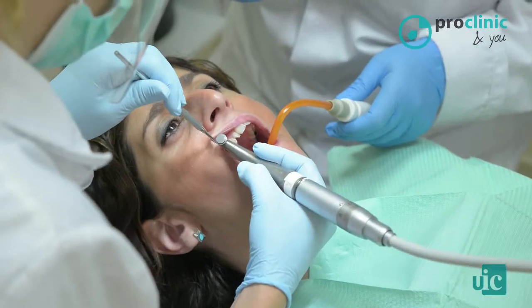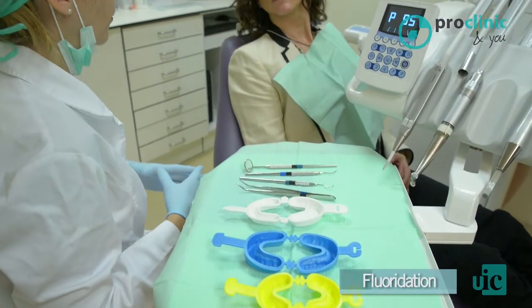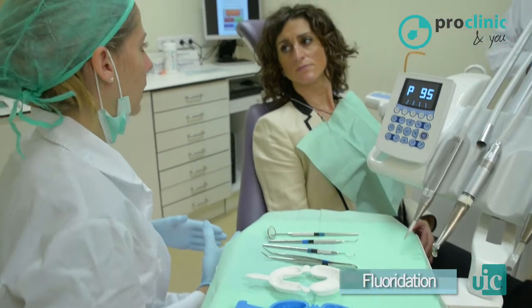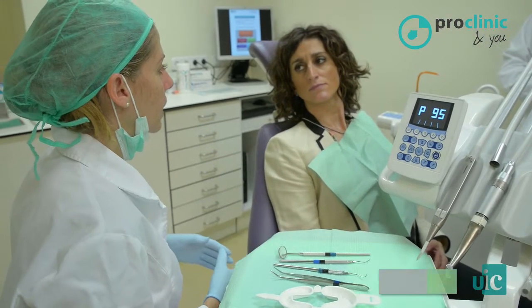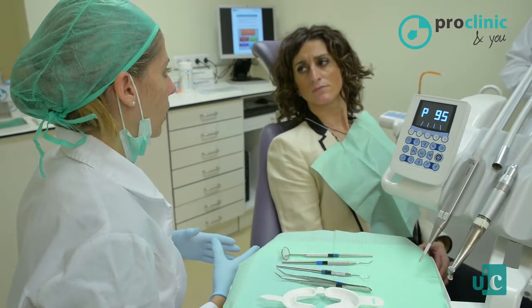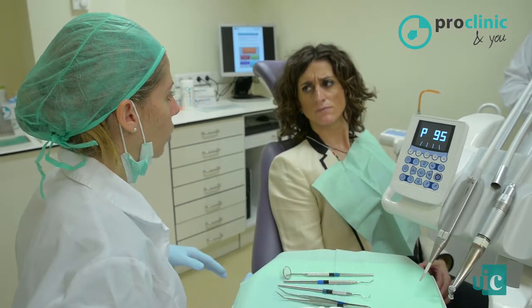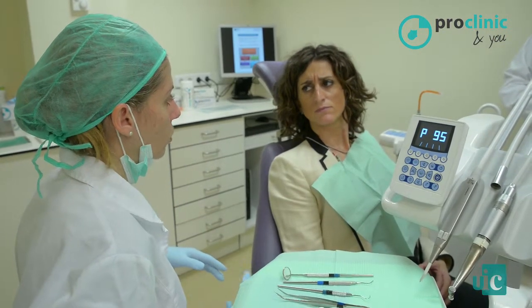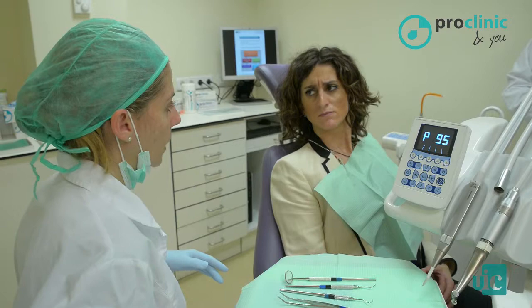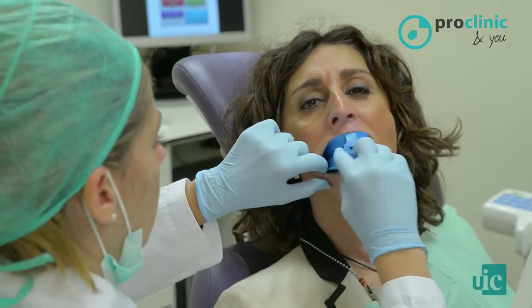Once we have completed the dental hygiene, we proceed with the topical application of fluoride to prevent dental caries. Then we should introduce a tray for about 2 minutes. It is important not to swallow it, and we will leave the ejector properly positioned so that all excess of fluoride would disappear.